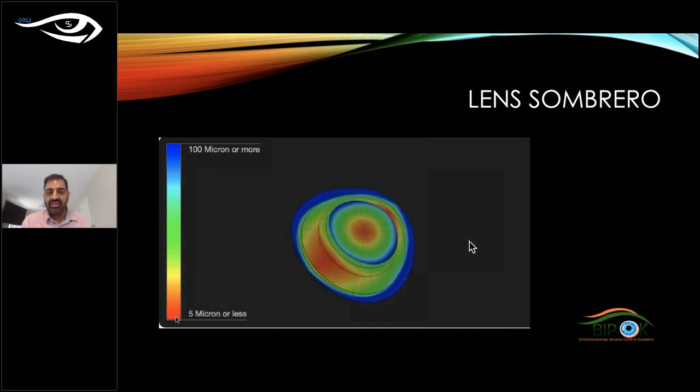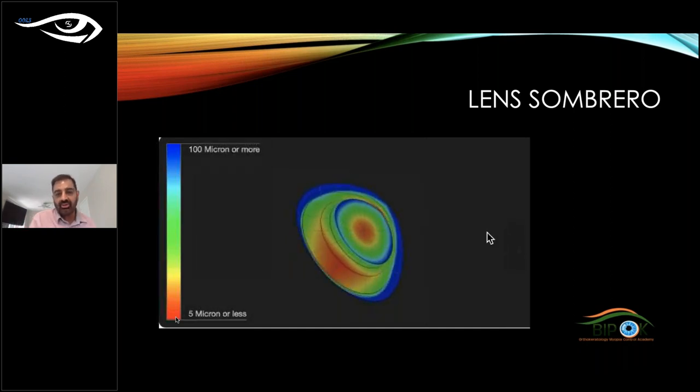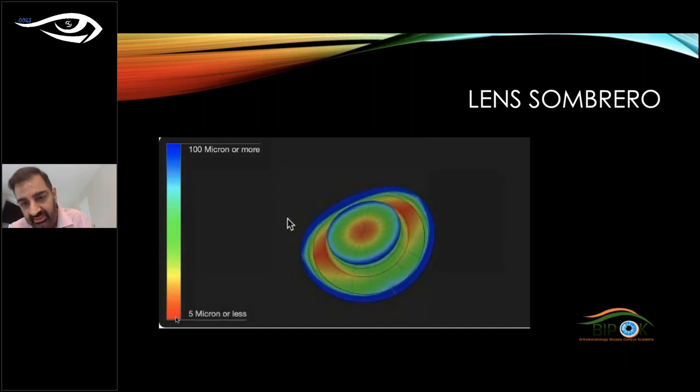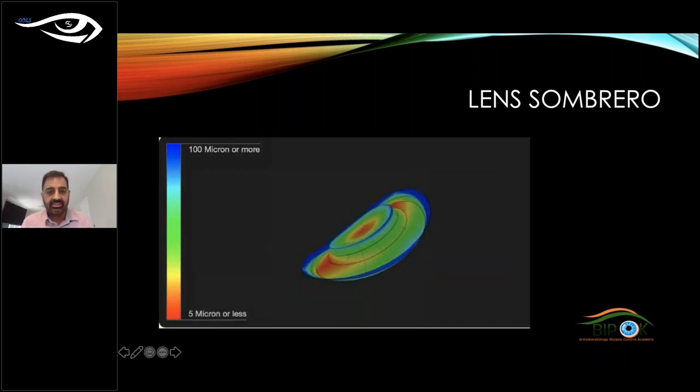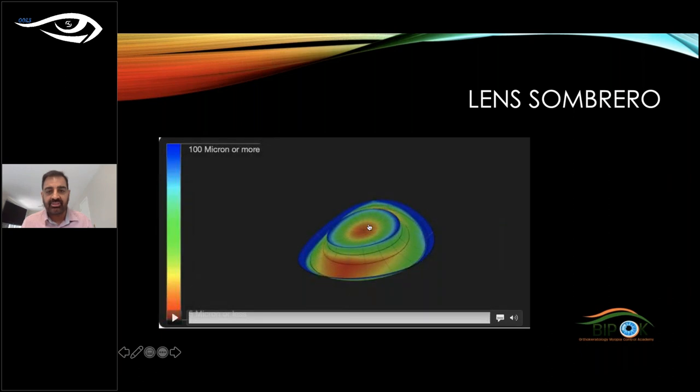Because remember the positive, negative, that's what you are going to create a contact lens on your cornea. The forces have to act on the cornea. Again, you can see the toricity is there. Therefore, this is the area where the forces are, but no force is there.